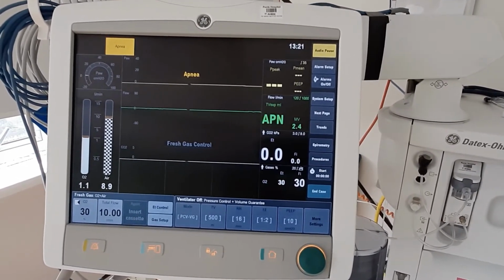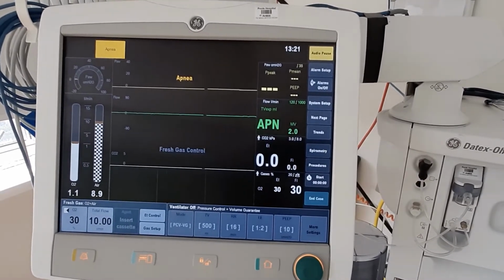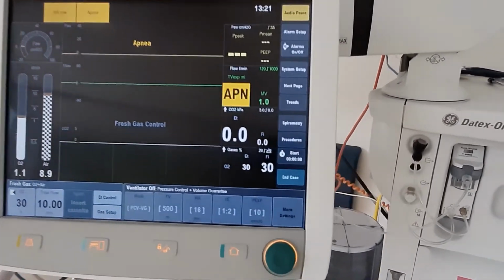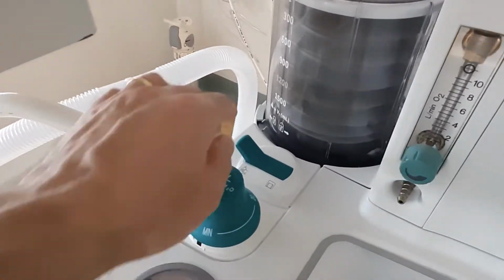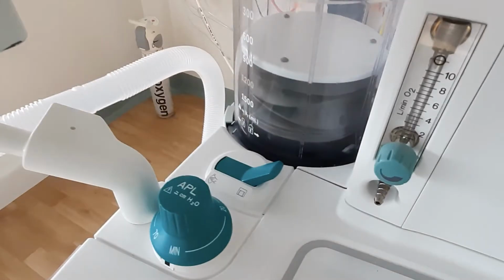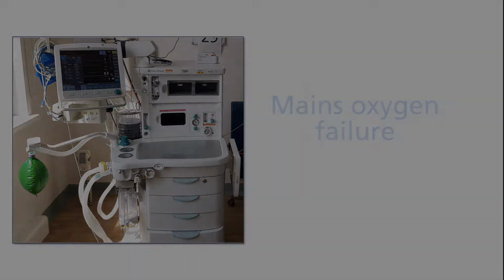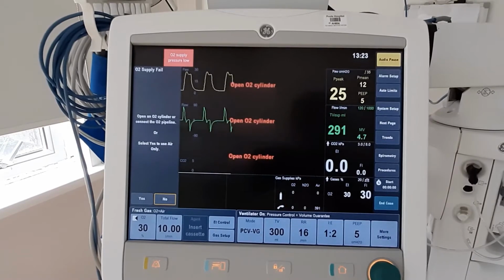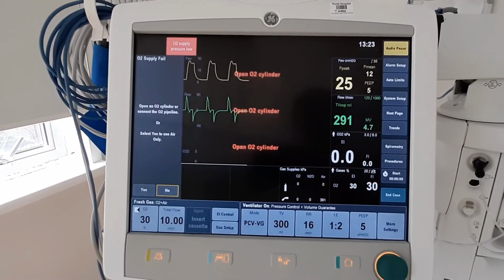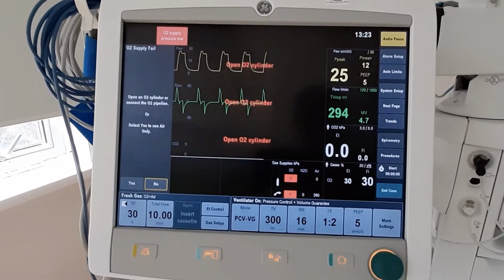Please also note that the apnea alarm on this anaesthetic machine is very quiet. As soon as we flick the switch to the right, ventilation commences. Another rare but possible problem is the failure of mains oxygen. This alarm sounds and an emergency message is displayed on the screen.